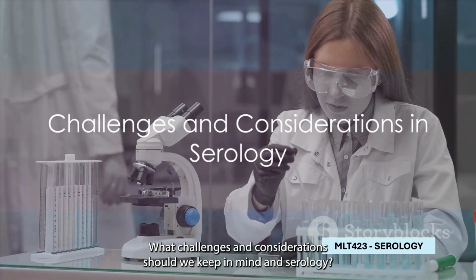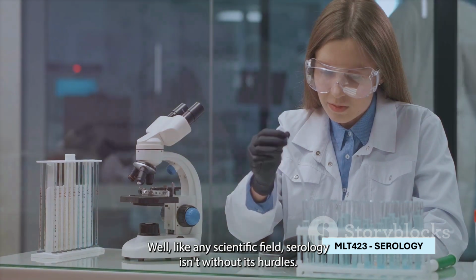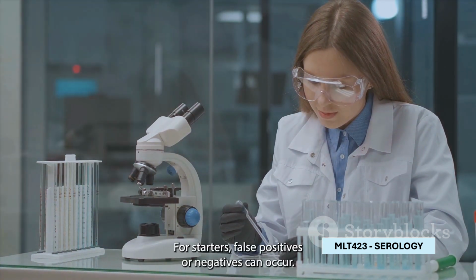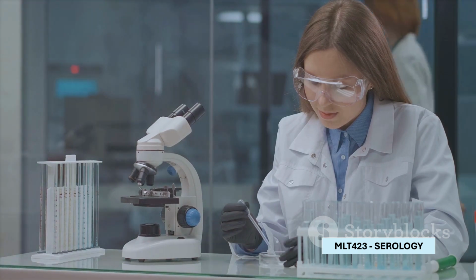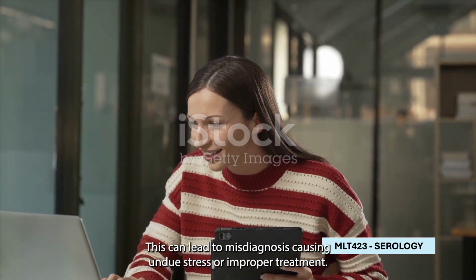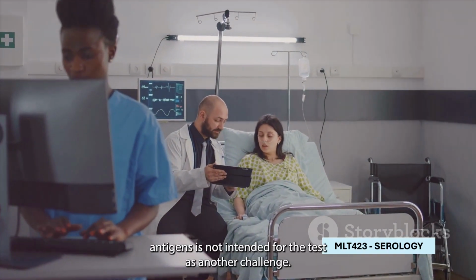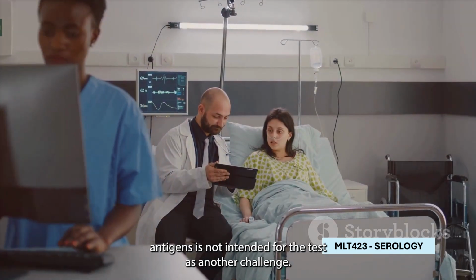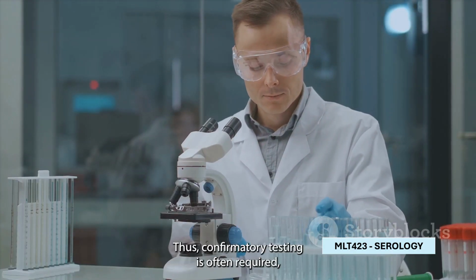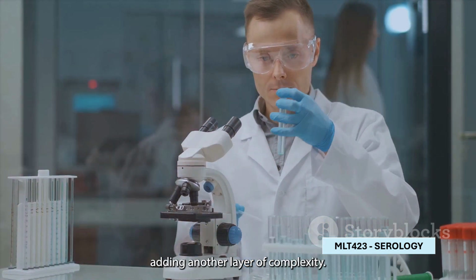What challenges and considerations should we keep in mind in serology? Well, like any scientific field, serology isn't without its hurdles. For starters, false positives or negatives can occur. This can lead to misdiagnosis, causing undue stress or improper treatment. Cross-reactivity, where antibodies react with antigens not intended for the test, is another challenge. It can result in inaccurate results. Thus, confirmatory testing is often required, adding another layer of complexity.